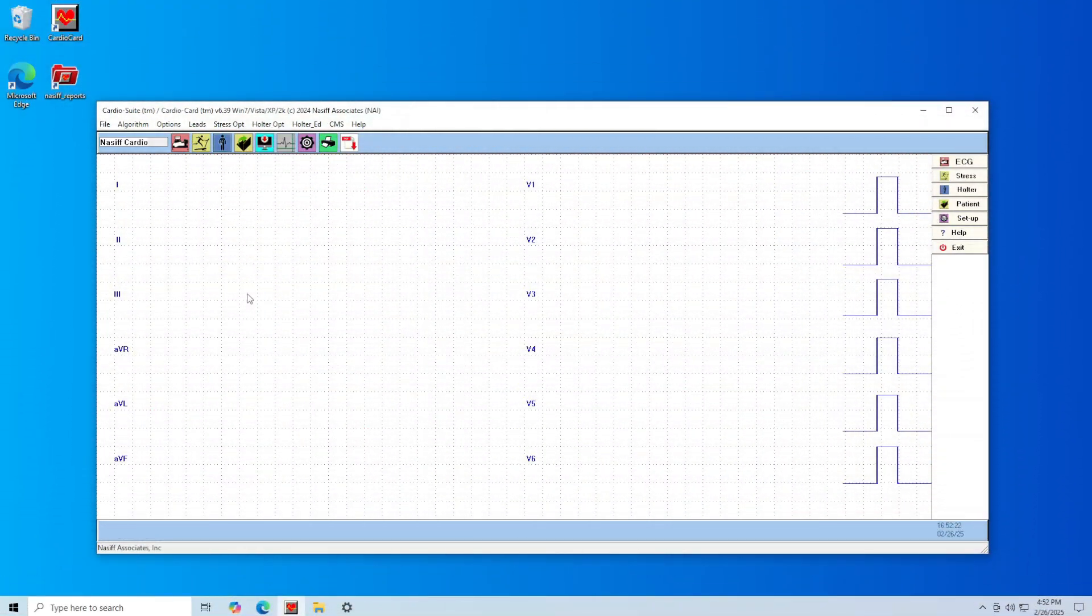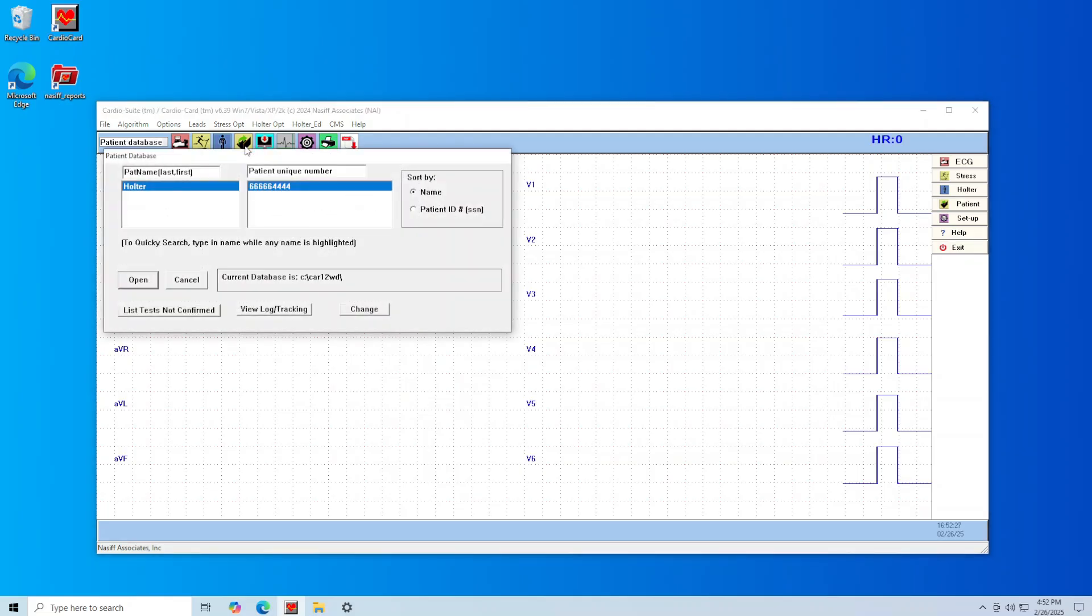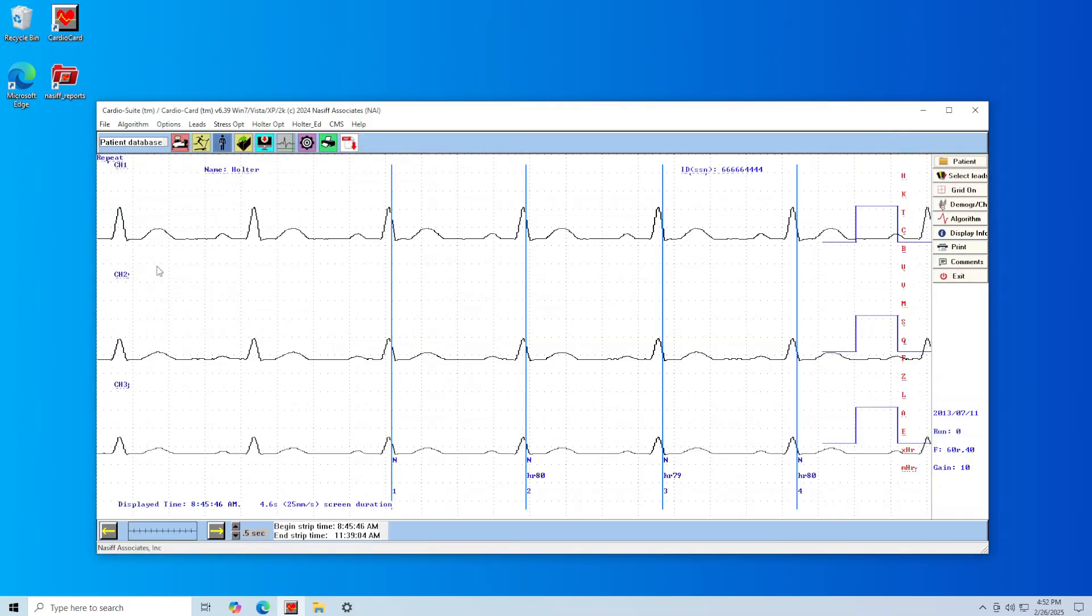Hello from Nasif Associates. In this video we are going to demonstrate how to use the Cardio Card Holter condensed editor. Once in the Cardio Card software, open your Holter test. To view this test in the condensed editor, click on Holter_Ed in the menu and select Condensed Editor.